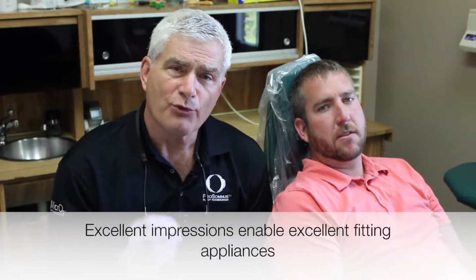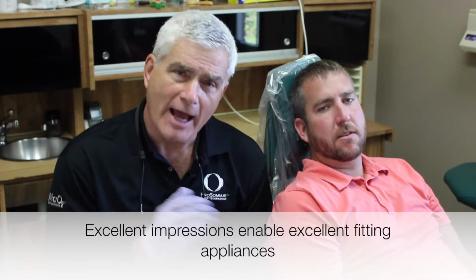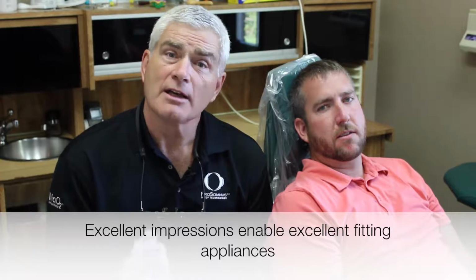The second reason is, we live in a digital world, and if I'm going to take an analog impression, it has to be so accurate that it fits seamlessly into that digital world. And in order to do so, we get this model, this digital copy of what we're going to do, that's so accurate that when we mill it out of the solid pucks of PMMA and other materials, they fit exquisitely well. They only do that if we start with excellence in, so we can get excellence out.